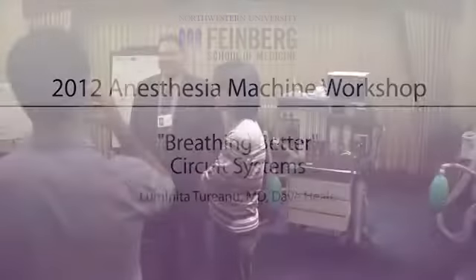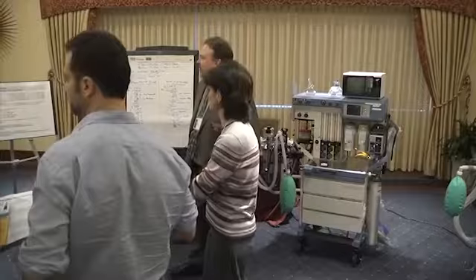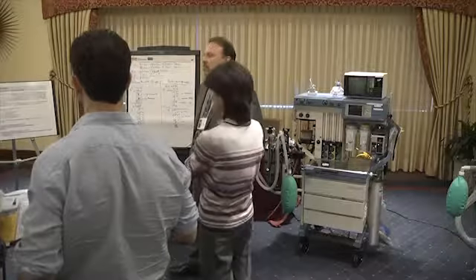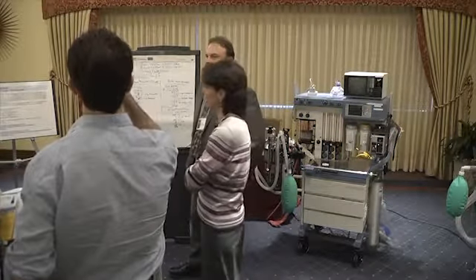This station has quite a few objectives. If you look over there, it's obviously not feasible to talk about them all. We will try to bring up the most important difference between these two particular machines, which relates to the contribution of the fresh gas flow to the set tidal volume, therefore the delivered tidal volume is different, and where these tidal volume discrepancies come from.